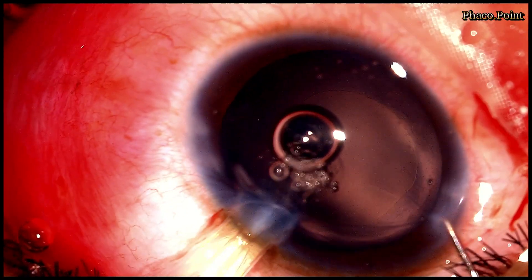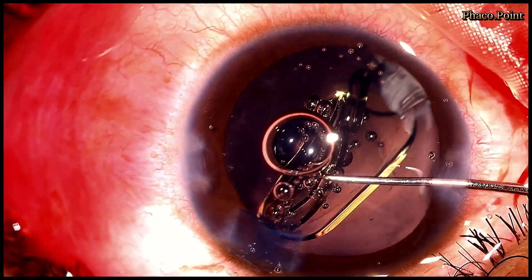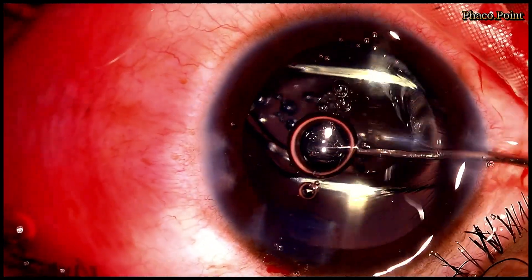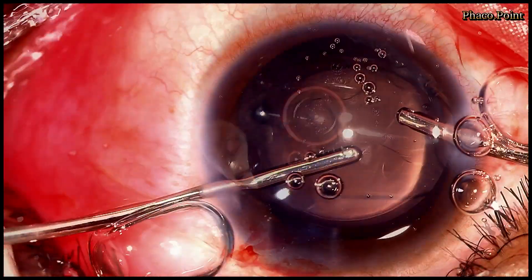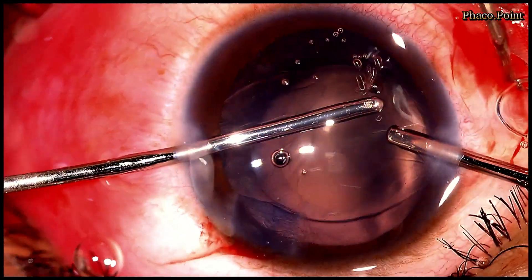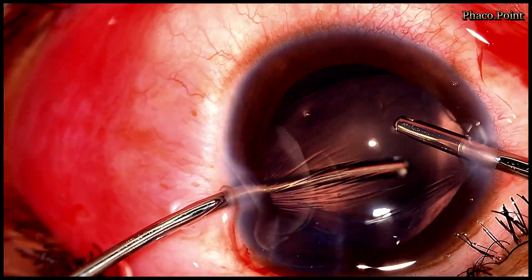Having aspirated the cataract and the cortex, I now proceed to the implantation of the single-piece monofocal IOL in the capsular bag. Having implanted the IOL in the bag and achieved a horizontal orientation, I now proceed to remove the rest of the viscoelastic from the anterior chamber as well as from around the IOL.